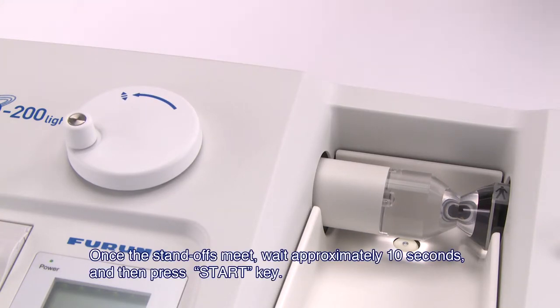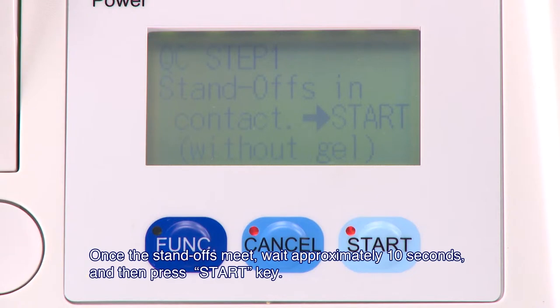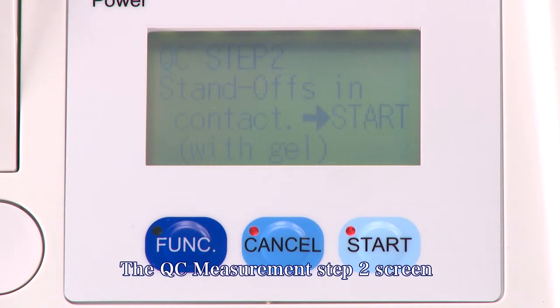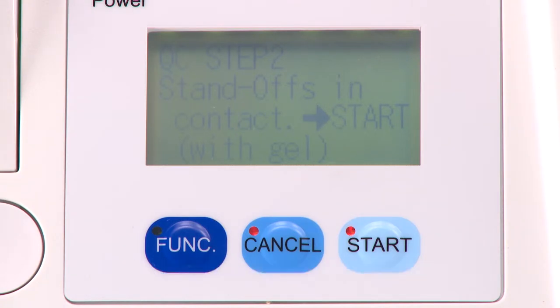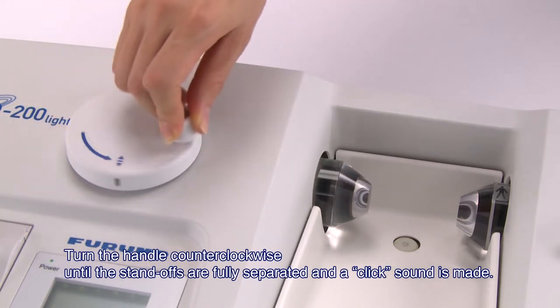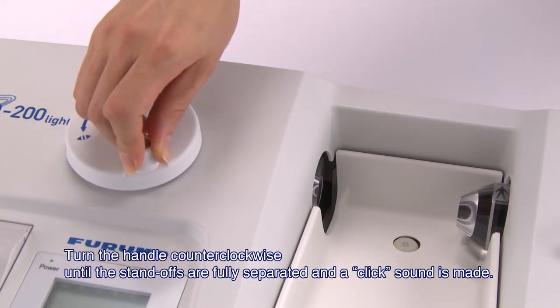Once the standoffs meet, wait approximately 10 seconds and then press the start key. When the QC measurement step 2 screen is displayed, turn the handle counterclockwise until the standoffs are fully separated and a click sound is made.